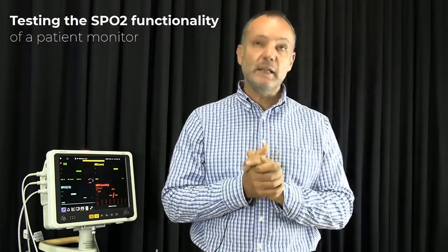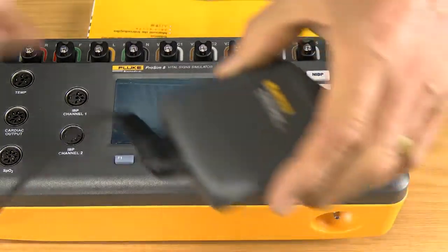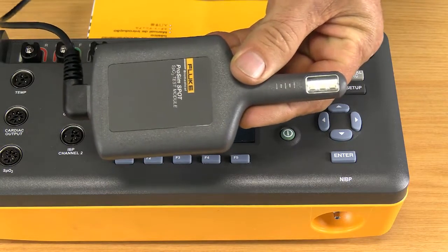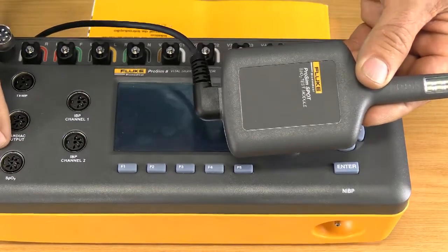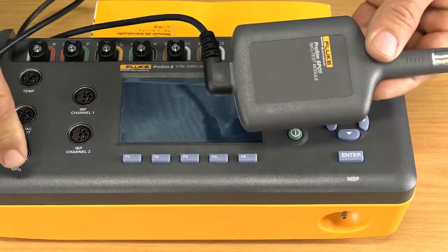Hi everyone, what we're going to look at now is testing the SPO2 functionality on your patient monitor. Again, we're going to be using the ProSim 8 simulator together with the ProSim Spot, which is the SPO2 simulator which you use with the ProSim 8. You'll see that on the ProSim 8 we have a connector here for SPO2. If I move it a little bit that way, you can see that. This cable just plugs in there.